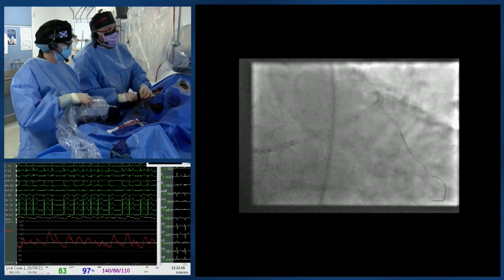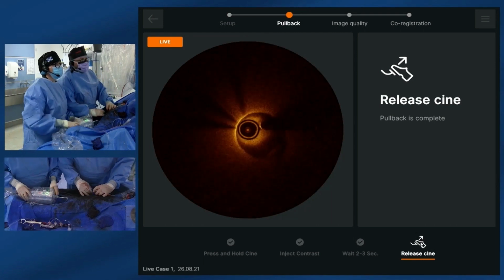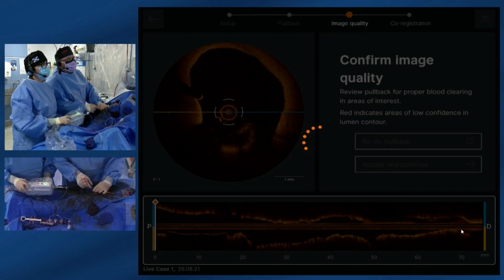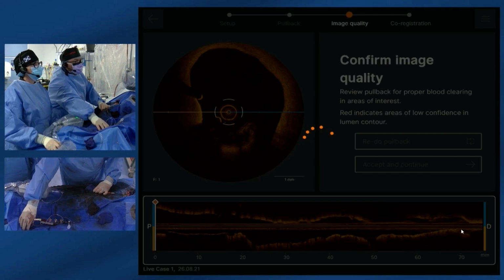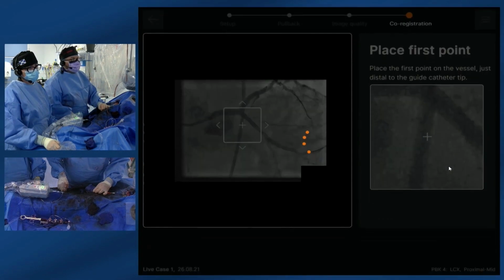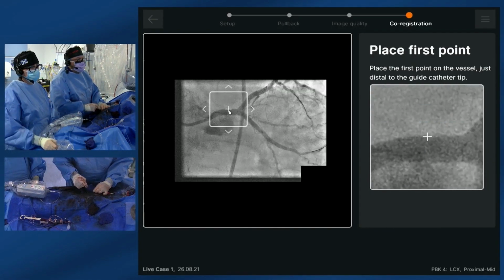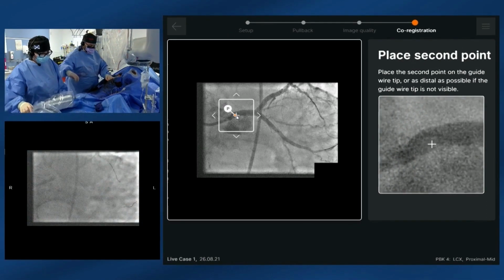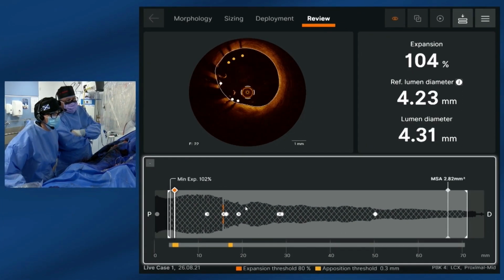Great. Very nice. Okay, good. So the catheter was just beyond the stent edge. Nice step down into the distal vessel and angiography is looking great. You can see we've held on to our first obtuse marginal, which is great. All the branches are single there. That all looks fine. But we'll see what the OCT tells us, because that's going to give us possibly a bit more information. We'll see, just on the flyby. It all looks good. There's no dissections there.